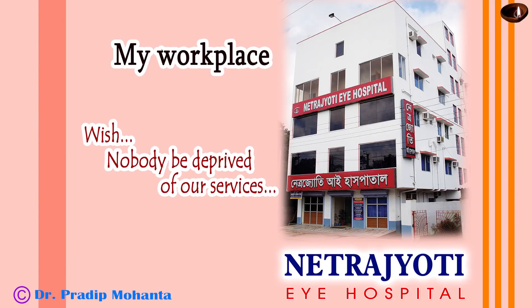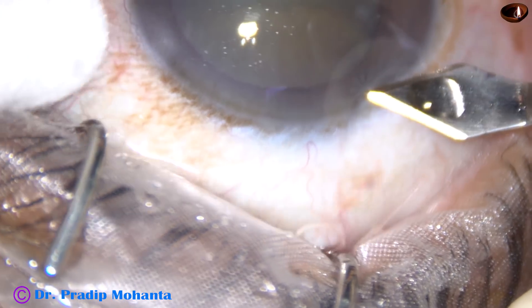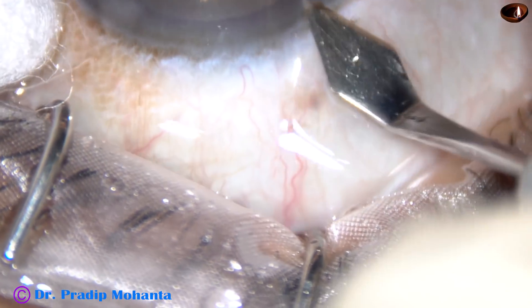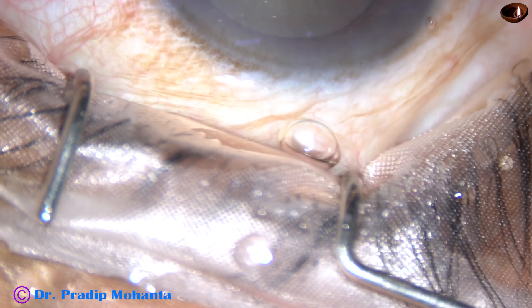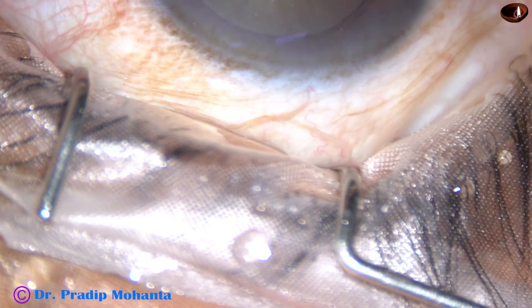Dear colleagues, welcome to my hospital at Ranaghat, West Bengal, India. This is a routine phacoemulsification by the Divide and Conquer Technique. The patient is under topical anesthesia. You can notice that I am not using any forceps.